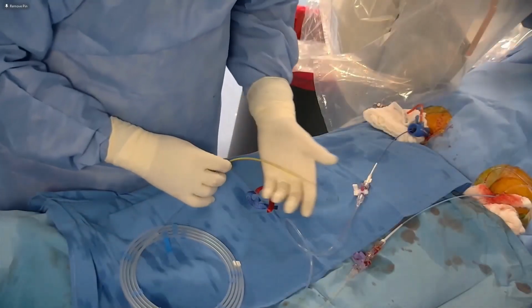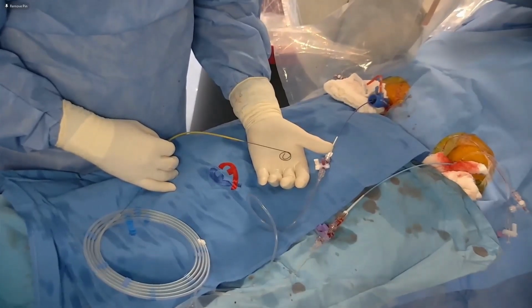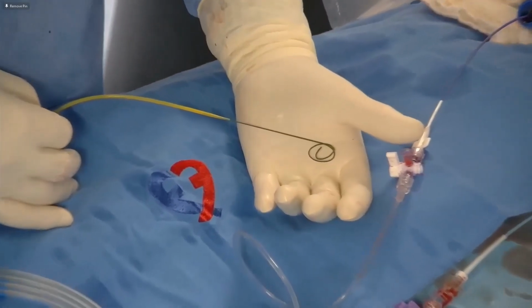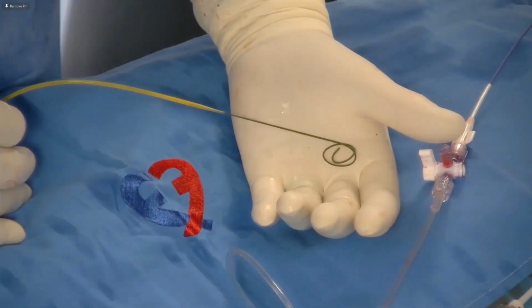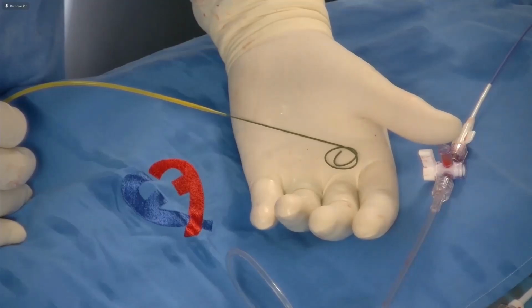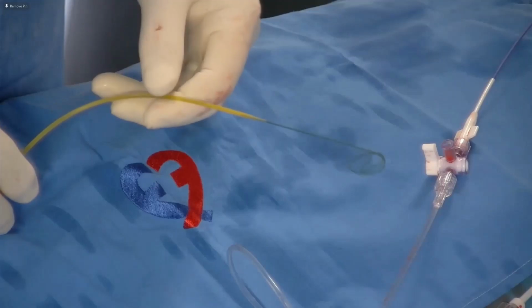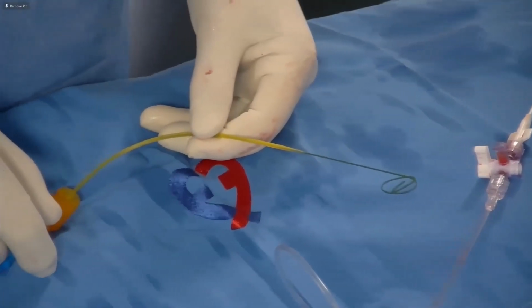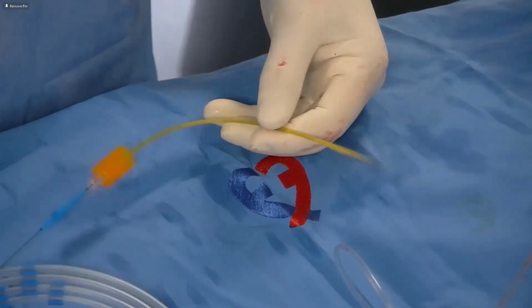Once again, you have observed how we reshape the wire. The loop at the tip, I always transform into an extra small. So I don't care if it is mild or small or big. All my wires become small, and then I add the second bend. I also usually do this kind of shape when we use the Lunderquist wire, which is a stiff wire.